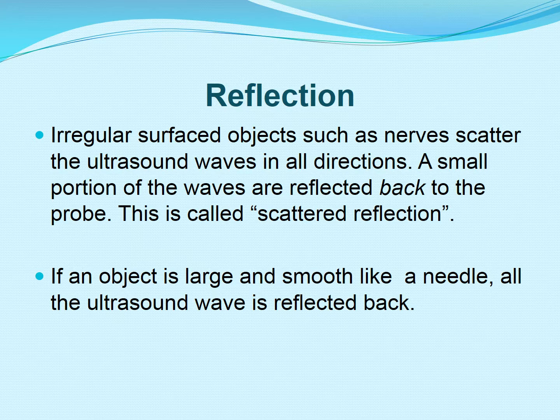The reason why you want to see this is because it's going to give you a view of where your needle is in regards to your vessel. This is very useful since it helps you to see clearly where the needle is. It's a mirror image like reflection. The waves will reflect back at you and you're able to see that.